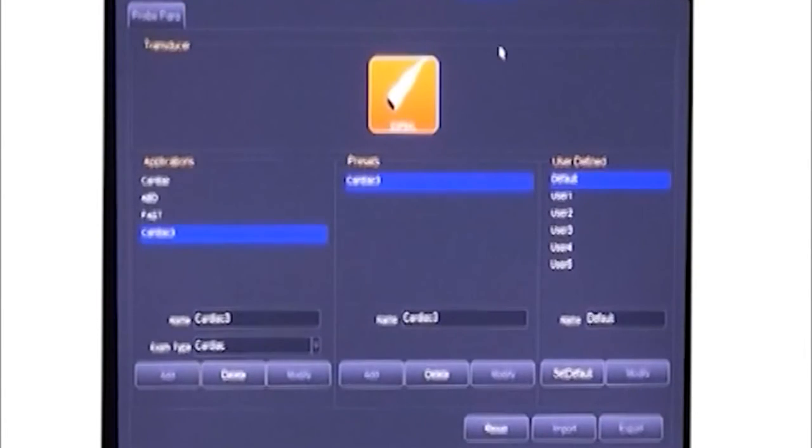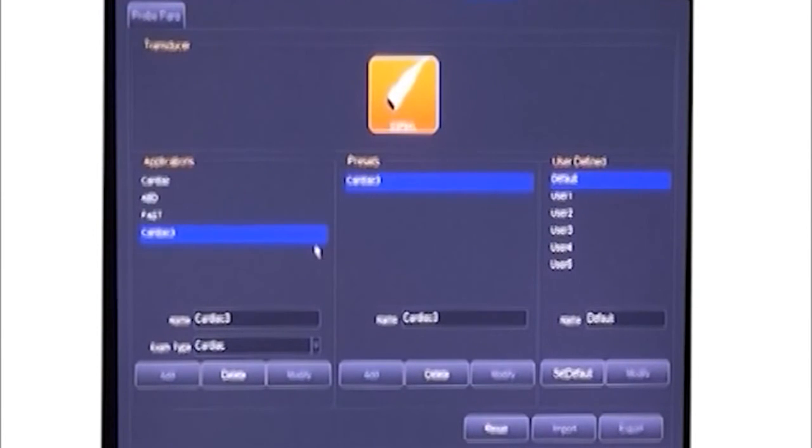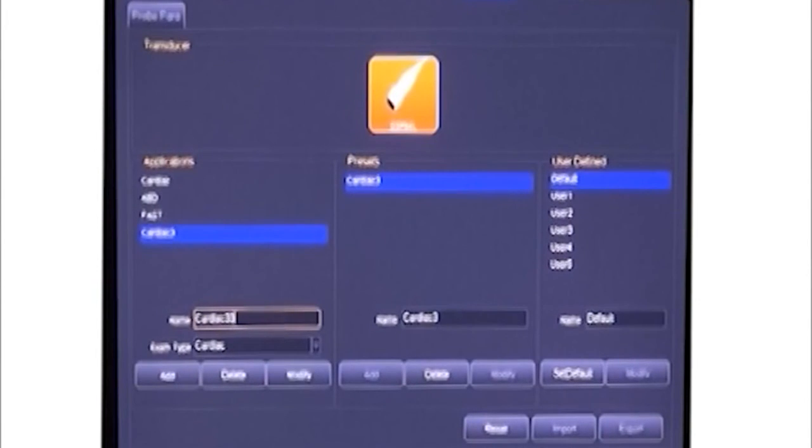The system has default presets, but here we can add new applications and presets according to the doctor's habit.